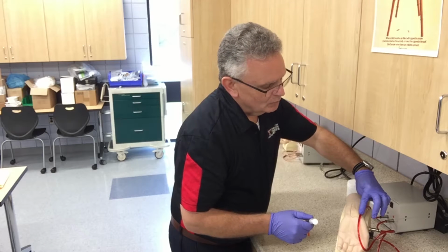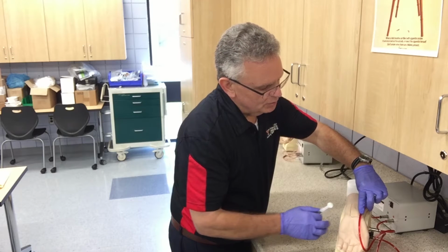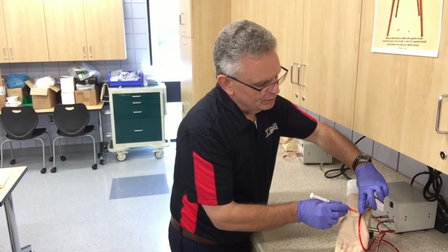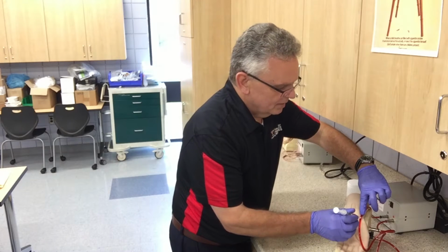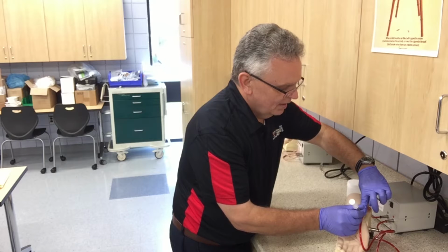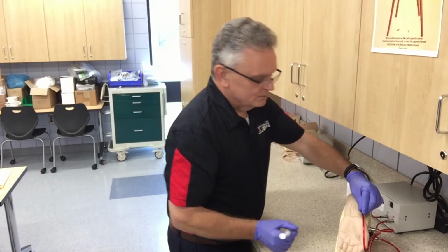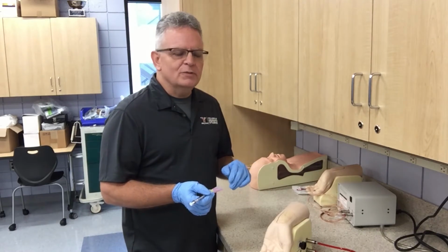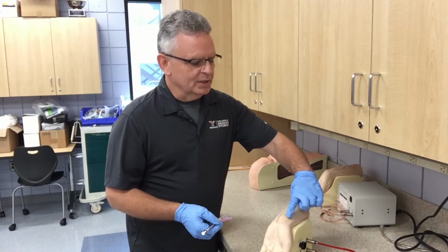So again, take your time, palpate the artery, make sure you can visualize where you want to stick. Roll your fingers side to side, align the middle of your finger with the strongest pulse point, and then use that as an aiming point for your needle when you make your initial puncture. And puncture just prior to your finger, obtaining an adequate sample. That's really all there is to it. And that stands for single finger aligned linearly.